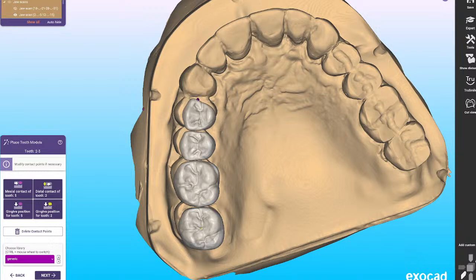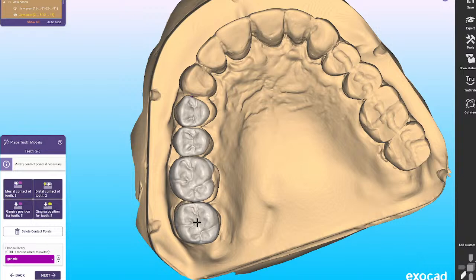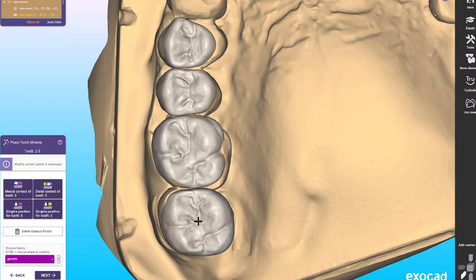Mouse pointer. Okay, let's change that. Okay, so this should be a little smaller. All right. So I dragged it to the mesial part over here. It doesn't have to be perfect. You just want to get it close enough. So let's put it right here.